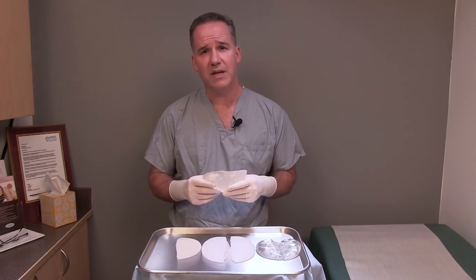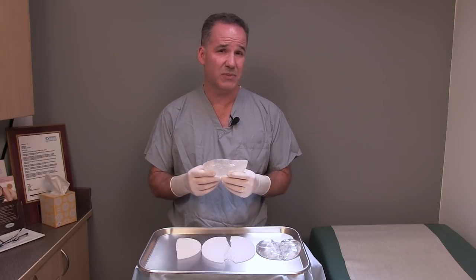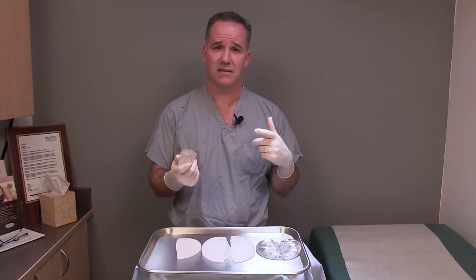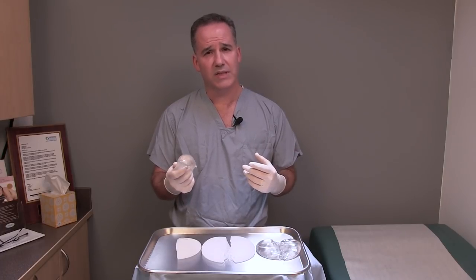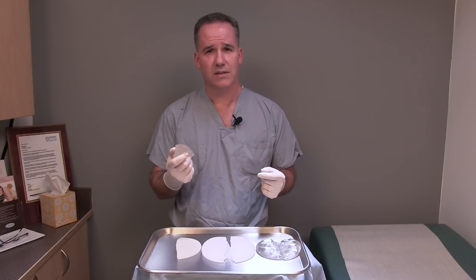So if you're thinking about having breast augmentation, I hope you'll consider having a silicone implant, because they really do seem to have a nicer cosmetic feel than saline implants do, and I really think it's a superior product. They feel much more natural and I think most of my patients are happier with silicone today.